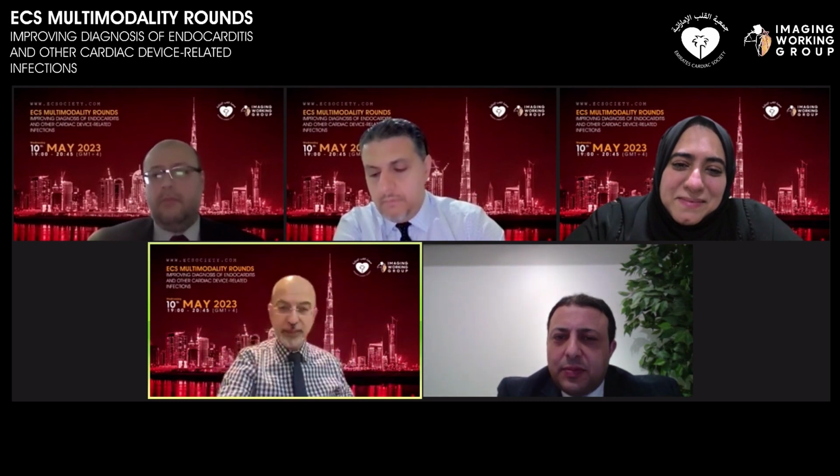So it's been looked at, and the additional value of the third TEE for better diagnosis was not much. So if you're still suspicious, you can do the FDG as Dr. Muad mentioned as number one, and CT sometimes can be helpful, but usually CT will look for complications rather than diagnosis. But you can also do that.